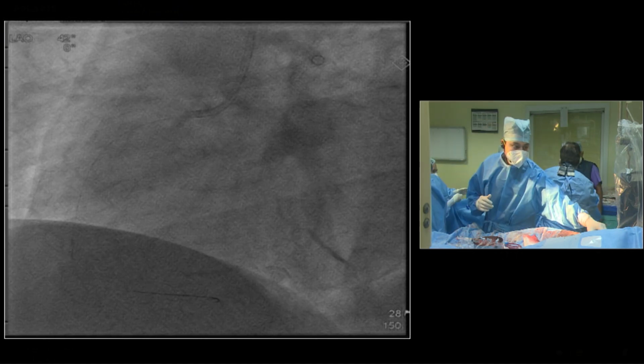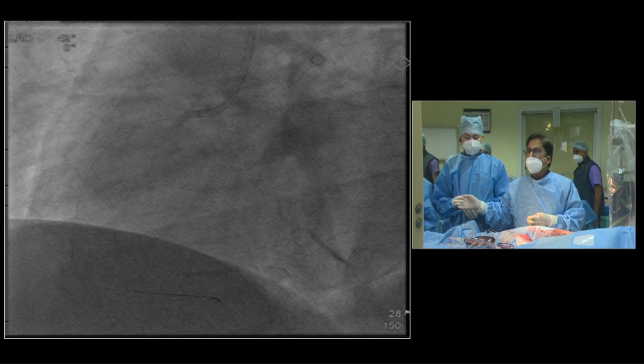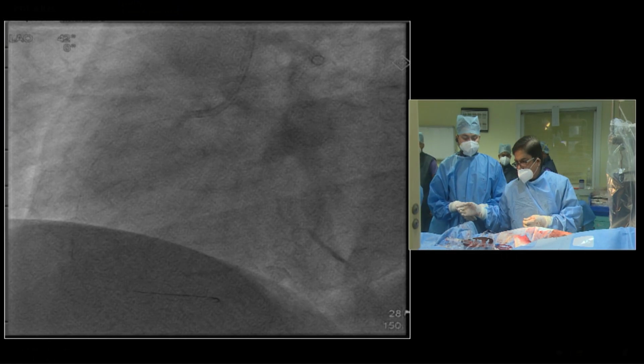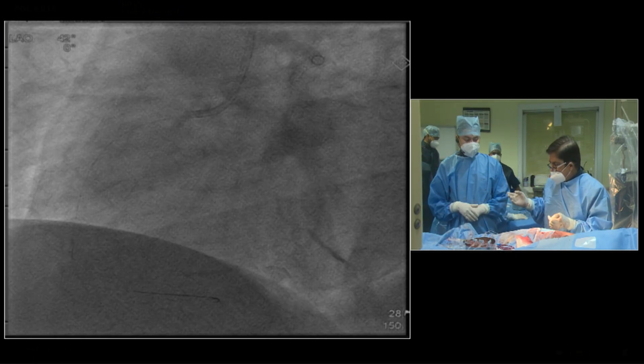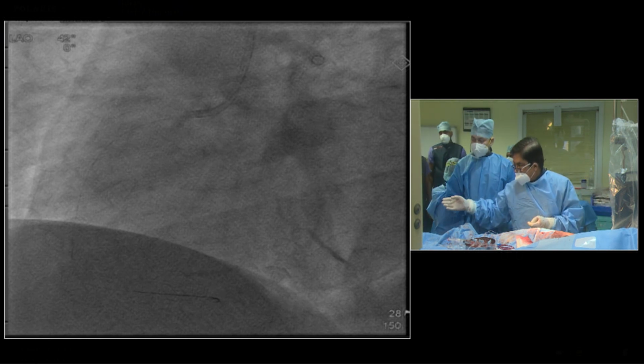I need a new wire. Come on, take that away. CTO interventions are expensive. You can't economize, you cannot adjust. You can adjust the balloons, yes. That is an internal matter, but you can't economize.